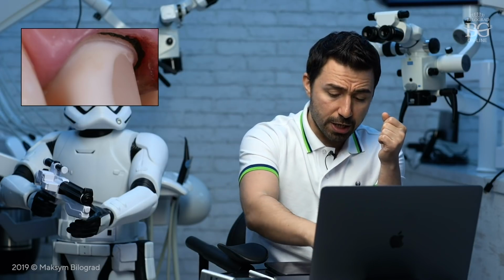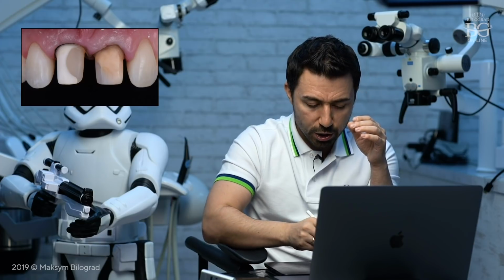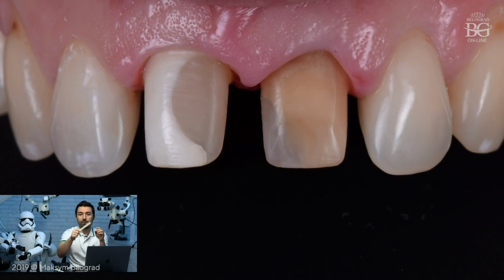Okay, and here you can see a picture when the lateral incisors were treated. So actually we removed caries defects, we made composite restorations here, and this picture was actually taken 2 days after root canal treatment and preparations. And you can see now, even though the conditions of soft tissues are not perfect, definitely, they are not super destroyed. The next picture that I would like to share with you is the picture after 4 weeks.